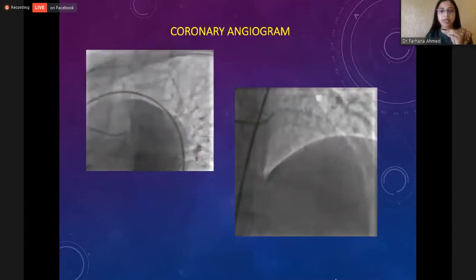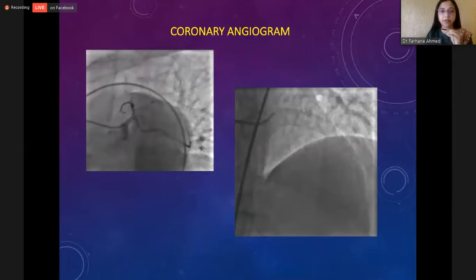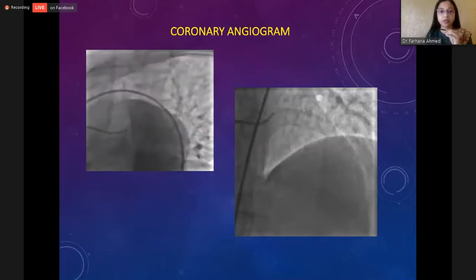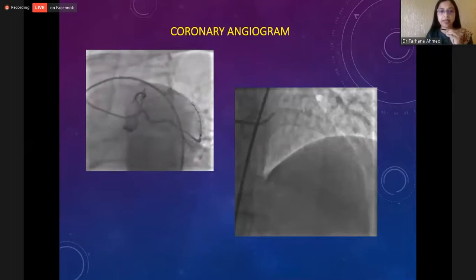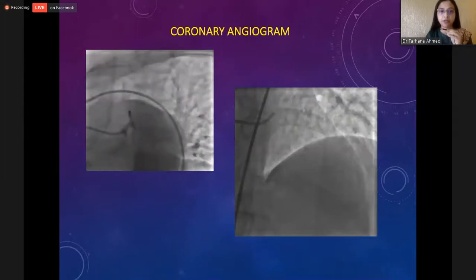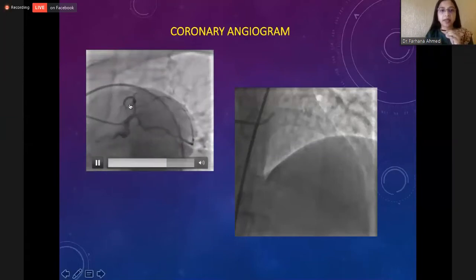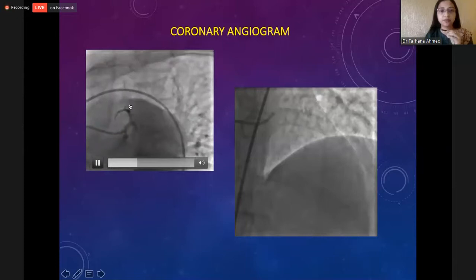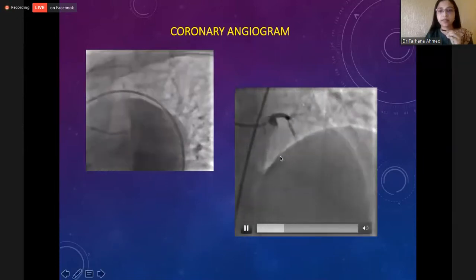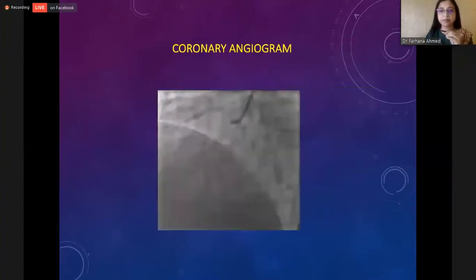As the patient had persistent chest pain, we decided to go for ultra-low contrast angiography. The idea is to keep the ratio of contrast volume to eGFR below 1, with minimal cine views to delineate the lesion. This is the caudal view. And the cranial view shows the significant plaque in the mid part of the LAD. And the RCA was normal.